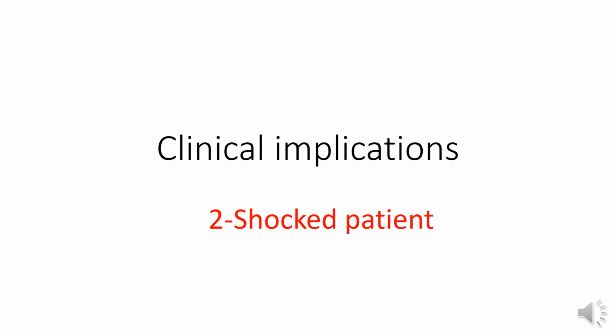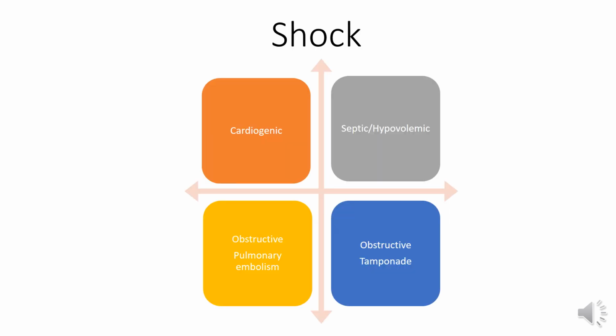Second scenario is a patient with shock. How might echo help in this scenario?